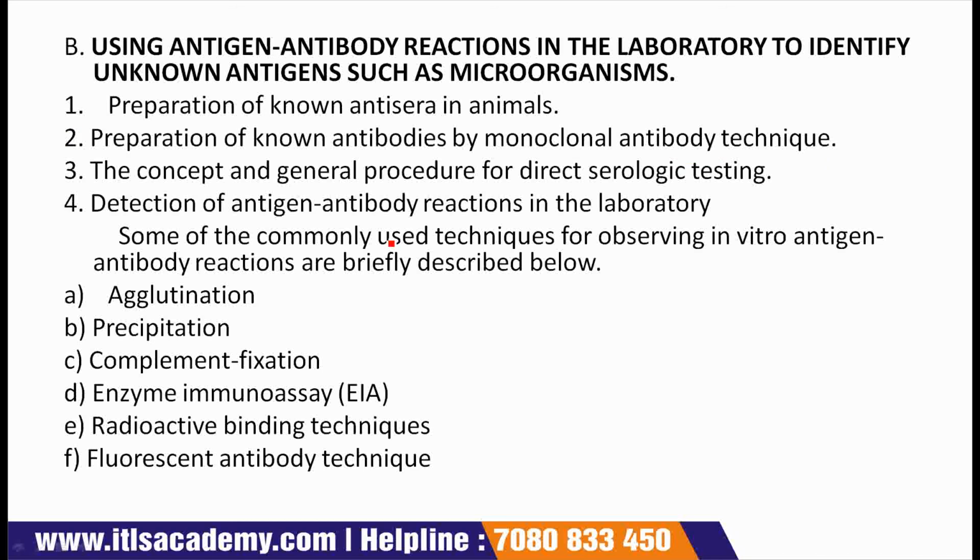Third point is the concept and general procedure for direct serological testing. A suspension of the unknown antigen to be identified is mixed with known antiserum for that antigen. One then looks for an antigen-antibody interaction or antigen-antibody reaction.